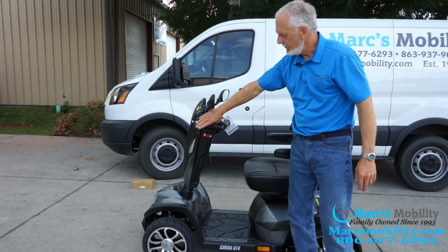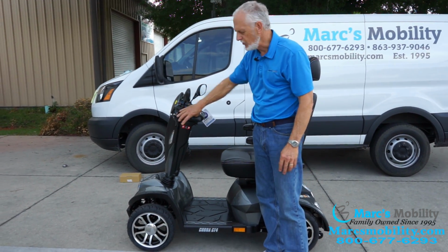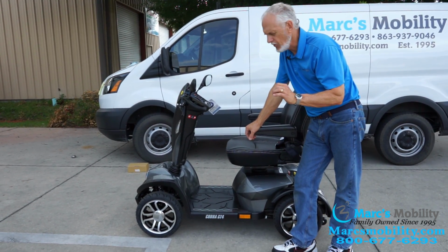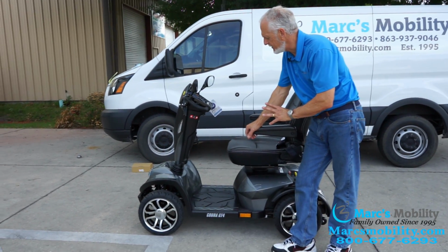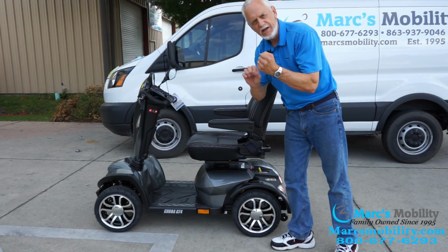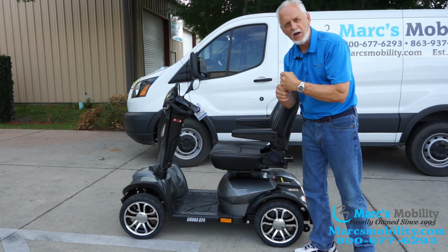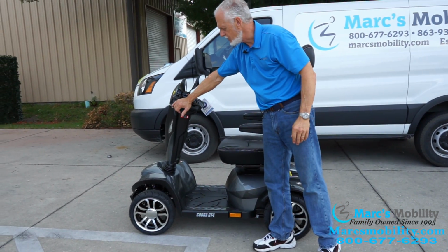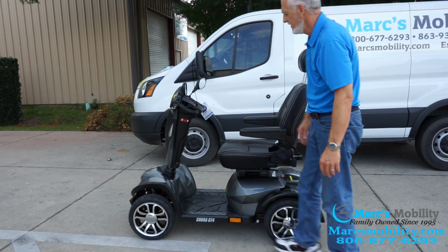It comes with an emergency brake, so if you're going down and you need to brake faster than the scooter will brake. Now this scooter has electromagnetic brakes, so it has a built-in brake in the motor. If you're going 10 miles an hour and you let go, the motor on the scooter will have a brake already coming. It'll stop within a few feet. But if you need an emergency brake, you have an emergency brake here also. You should not have to use this, but it's there in case.